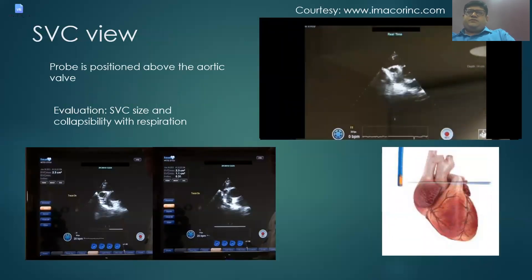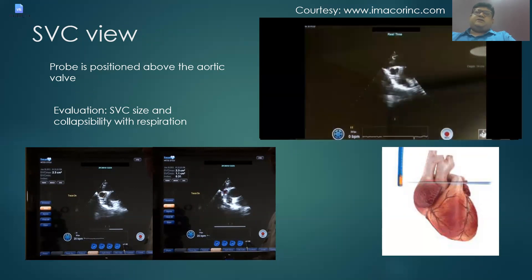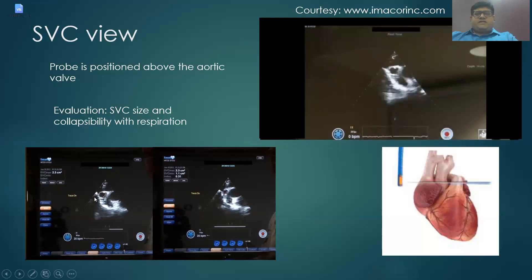The last view is the SVC view. The probe is positioned just above the aortic valve at the level of the ascending aorta and turned slightly to the right to bring the SVC into center. This view is not in the ASE comprehensive guidelines but has gained significance in critical care echocardiography. It is used to evaluate SVC size and collapsibility with respiration. The maximum and minimum diameters are mapped, and the machine automatically calculates the collapsibility index.